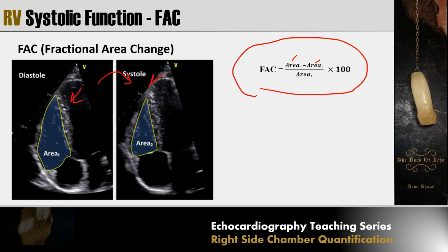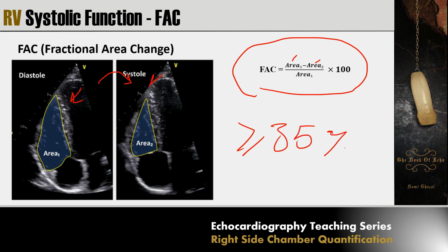The normal is 35% and more. So normal is more than 35%.